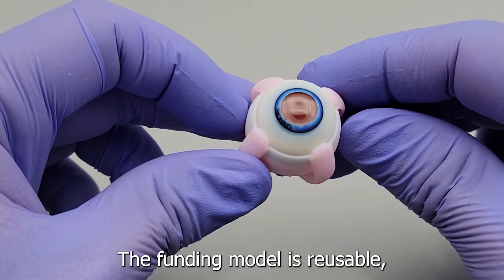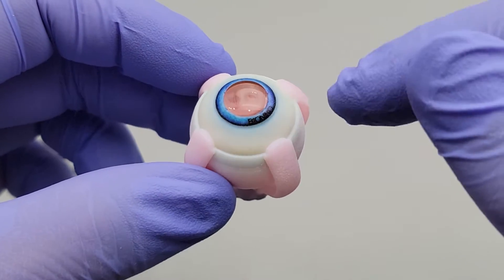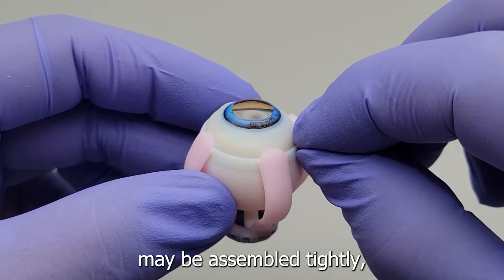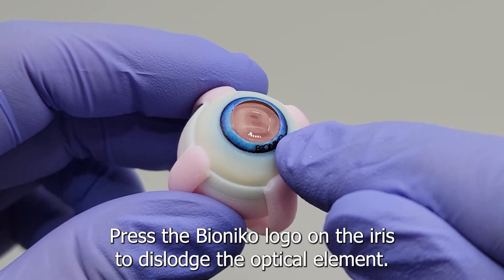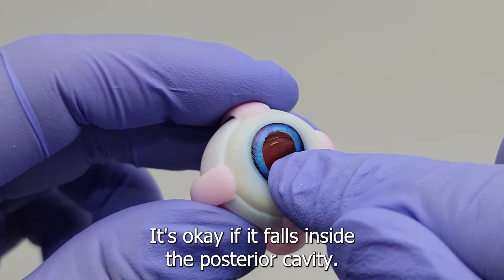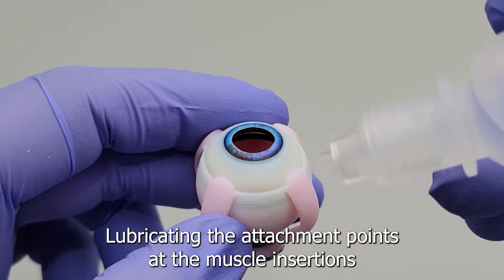The fundus model is reusable, so we must learn how to assemble and disassemble it properly. When new or sealed, the anterior and posterior segments may be assembled tightly, so we need to disassemble it as follows: press the Bioniko logo on the iris to dislodge the optical element. It's okay if it falls inside the posterior cavity.